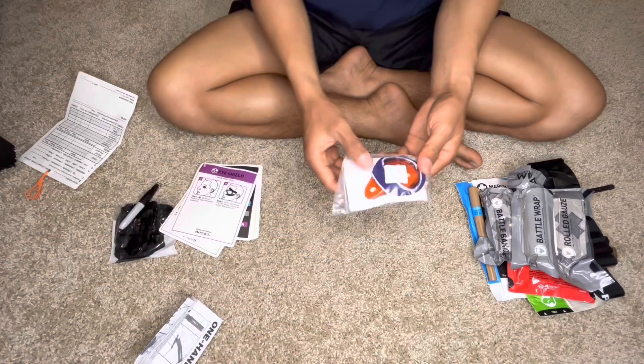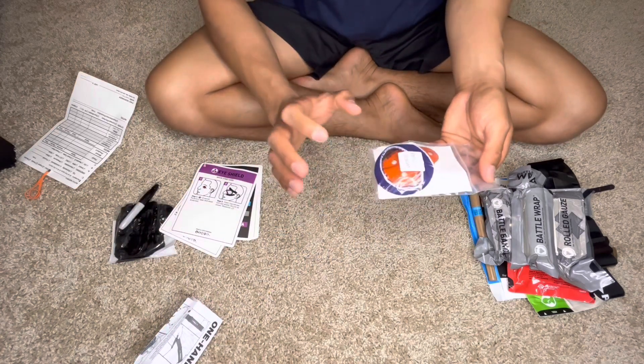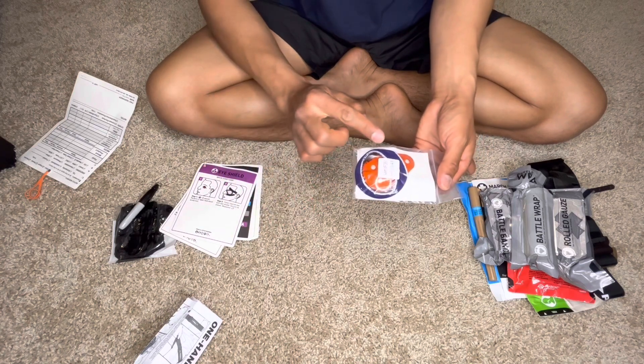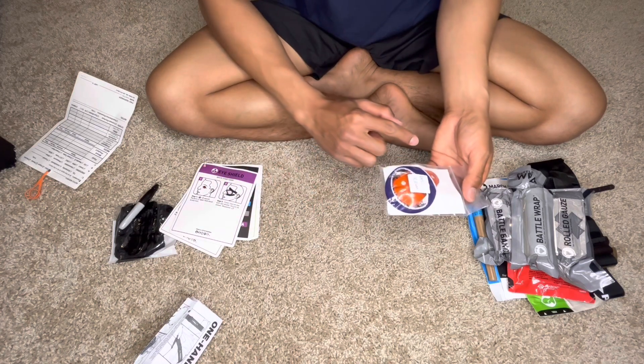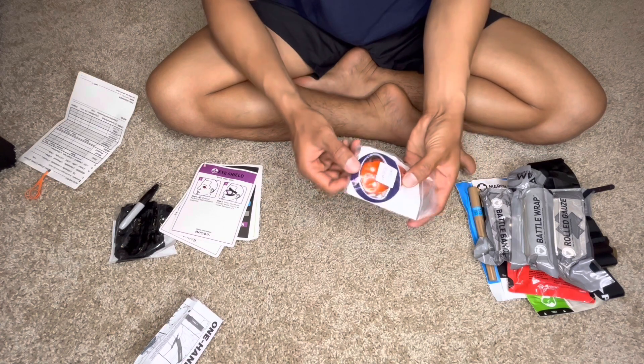And then the eye shield. This is the eye shield. I'll show you on a different video the comparison of the eye shield we used before and the one the army issued now — this is the latest one.